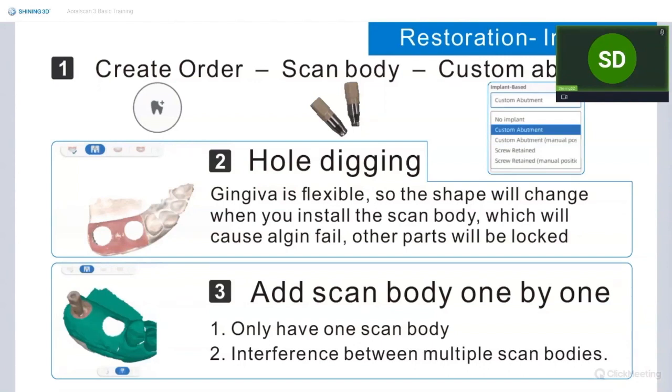When you do the scanning, the scanner tip has different angles, and the structured light that comes from our projector will have different shadows. So these shadows in different places will cause the color to vary. So that's it.